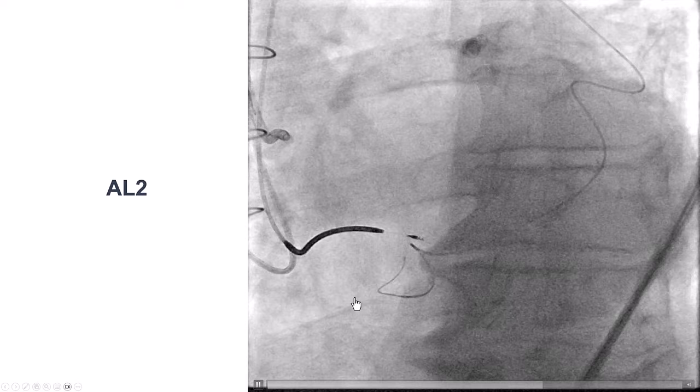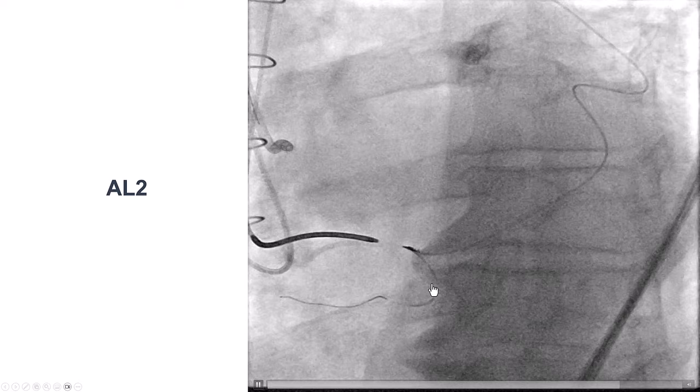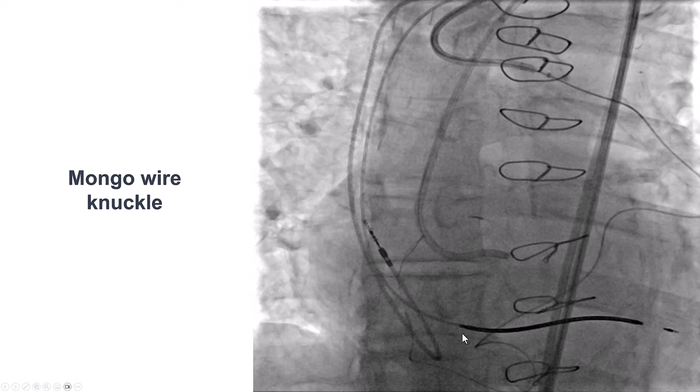Once again, we were able to navigate through the collateral and enter into the distal right coronary artery. We then used a Mongo guidewire, and now with the stronger support — the AL2 goes deeply into the vein graft of the OM — and with a guide extension, we were able to advance the Mongo wire knuckled almost all the way to the ostium of the right coronary artery.